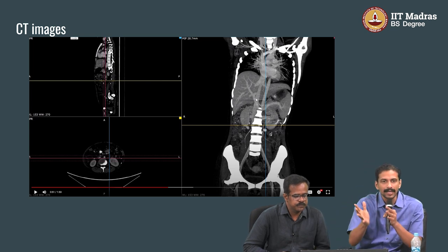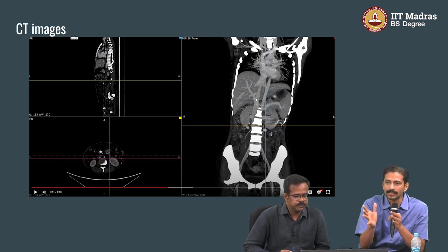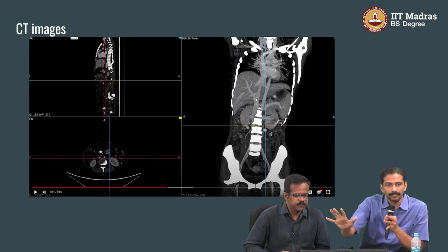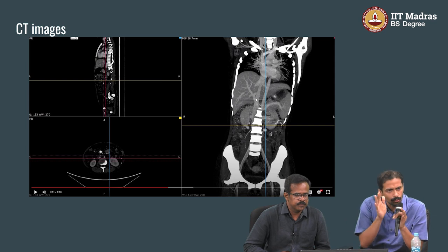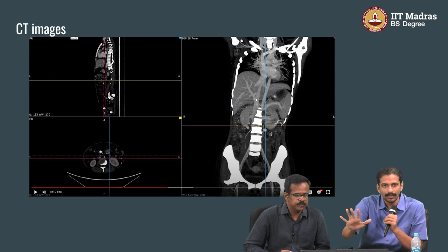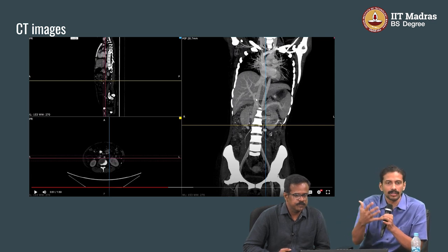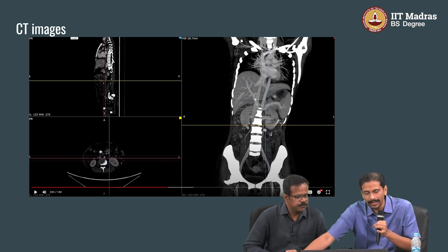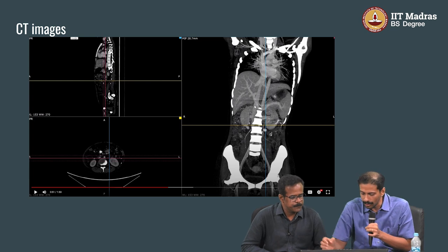So if you manipulate the image, you can highlight a few things, and at the same time, you can suppress a few things. This is post-processing. The source of the image is the same, which we looked at in the previous slide. It's the same data set, but by the way you manipulate it, you can bring out the structures you want to see better. All this can be automated, or you can use various algorithms to make it more user-friendly.